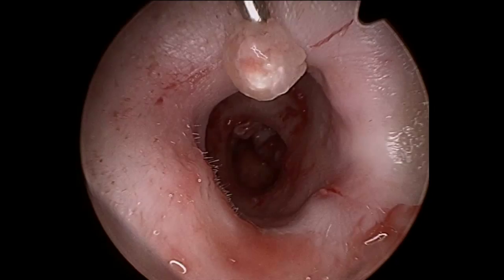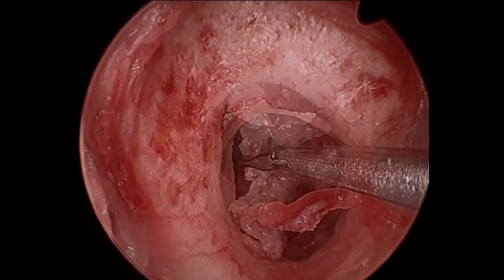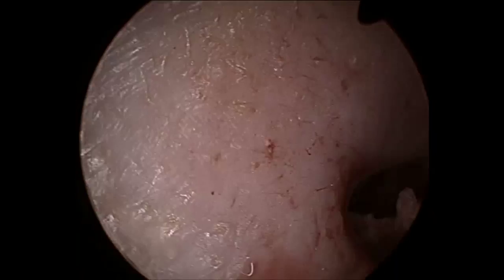Curved suckers as well as hockey stick and angled fish dissectors are used to get around the top of the sac. Debulking the sac allows access to the superior part of the cholesteatoma.